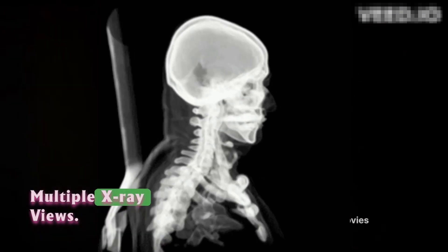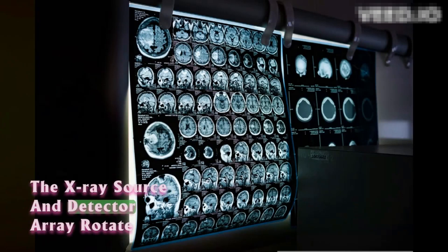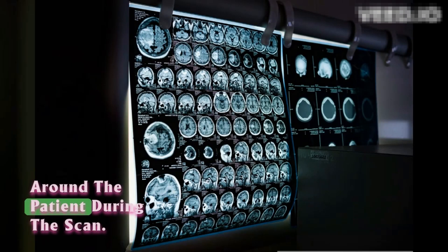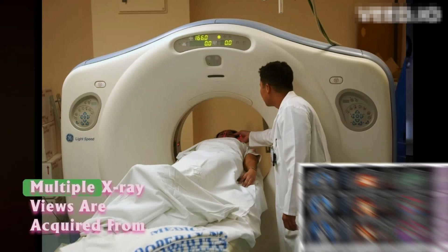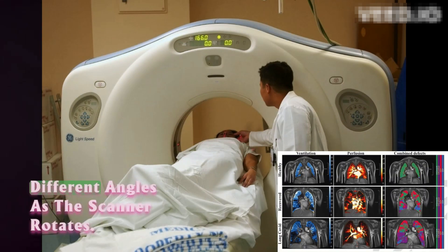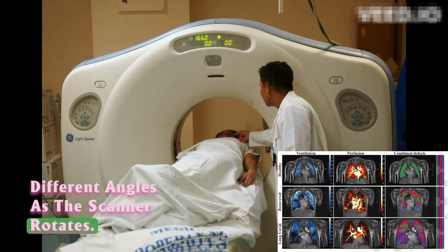Multiple x-ray views. The x-ray source and detector array rotate around the patient during the scan. Multiple x-ray views are acquired from different angles as the scanner rotates.